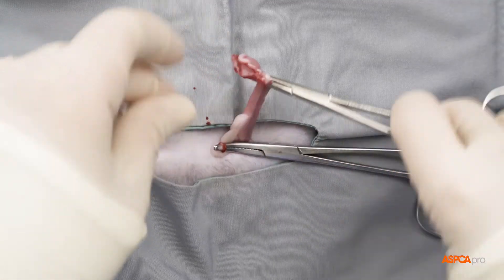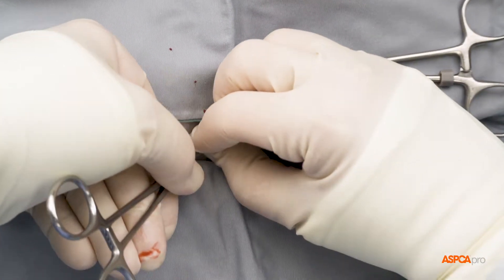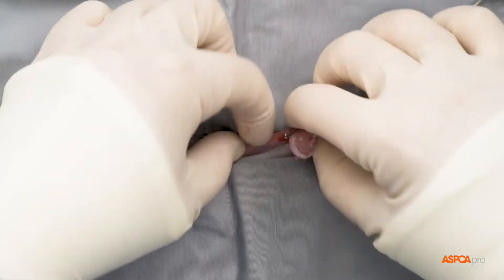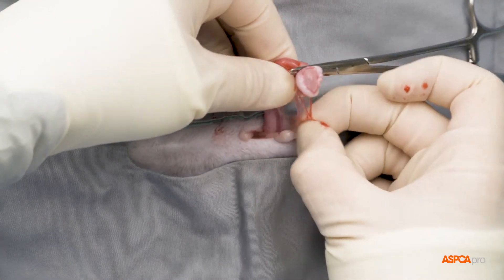The knot is tightened, and once the surgeon confirms that there is no bleeding — known as hemostasis — or remaining ovarian tissue, the pedicle is returned into the cat's body.